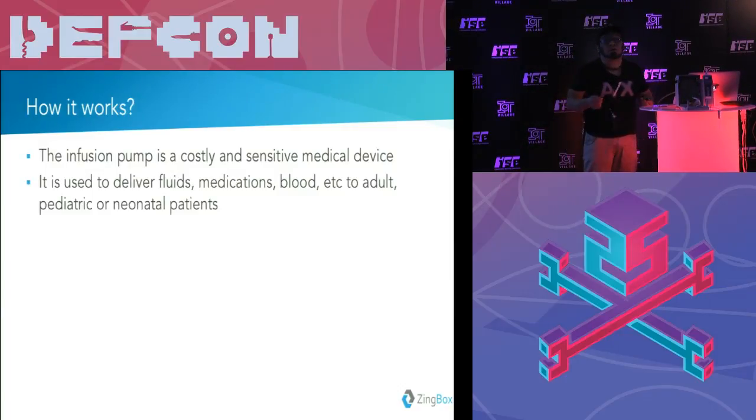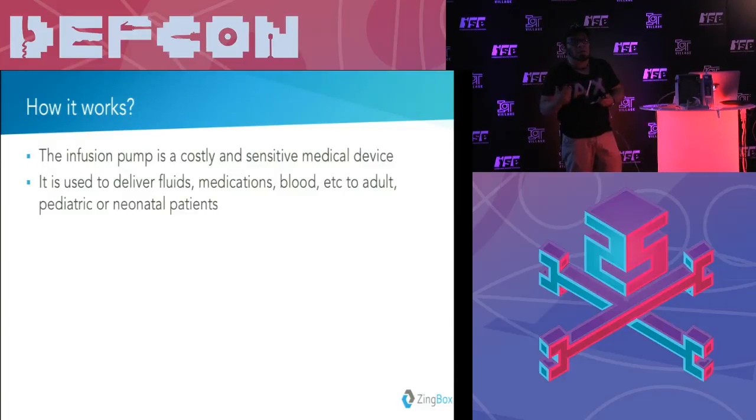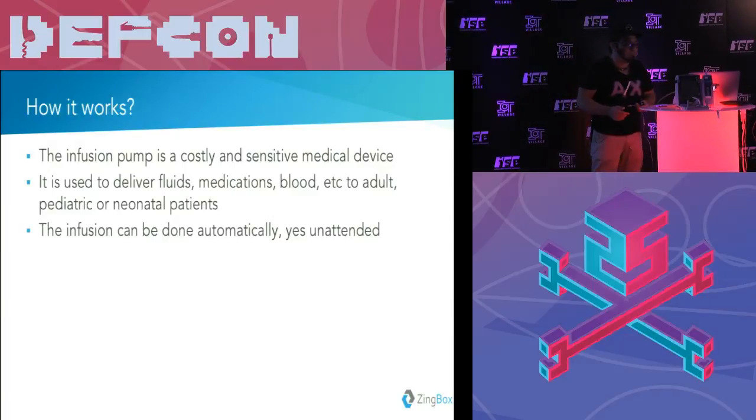And if there are issues, imagine that, for example, it is insulin and it requests 100 milliliters, and for some reason it's just giving 50 milliliters. That's not enough, so the patient is not going to be doing well in health. Or on the opposite side, if you give more than expected, it's also something that you don't want to have.